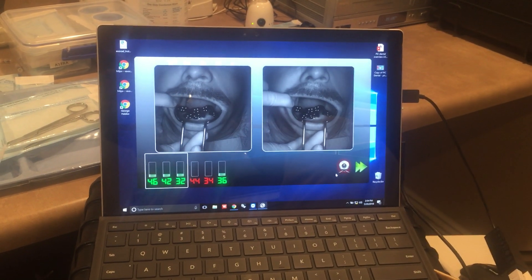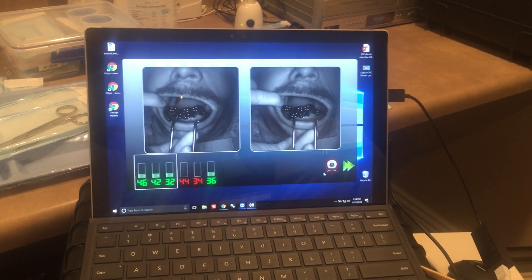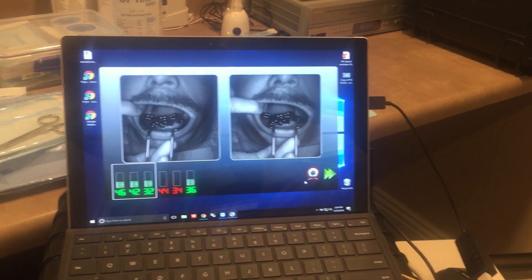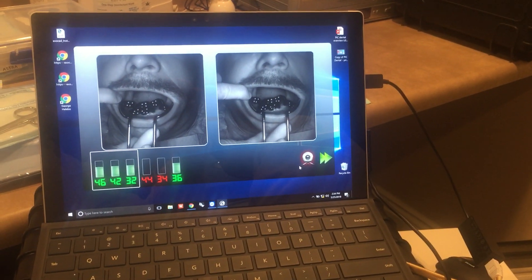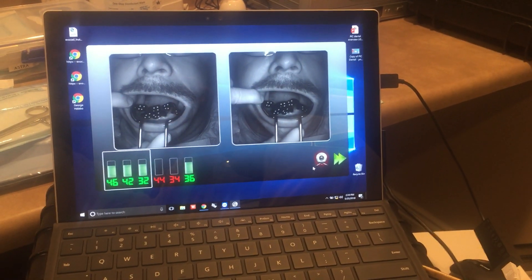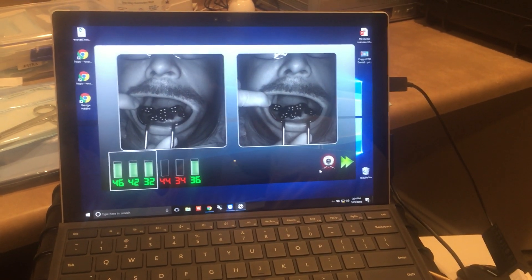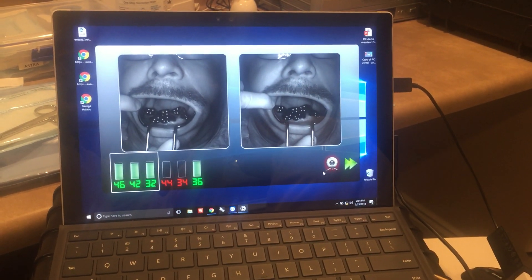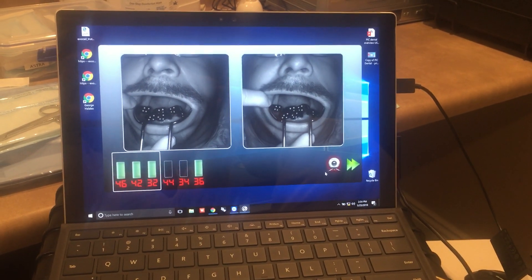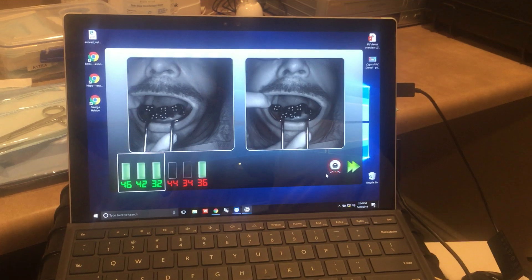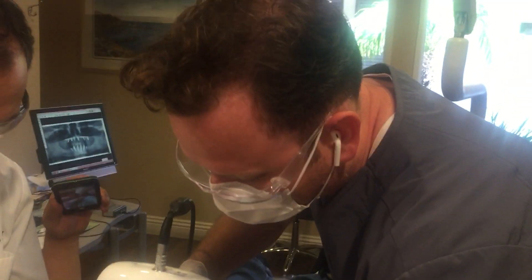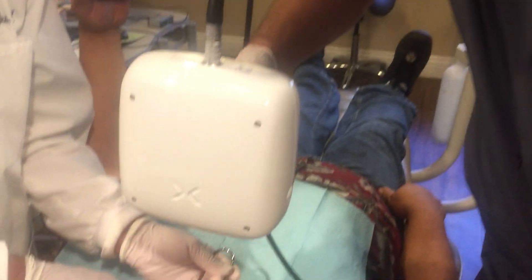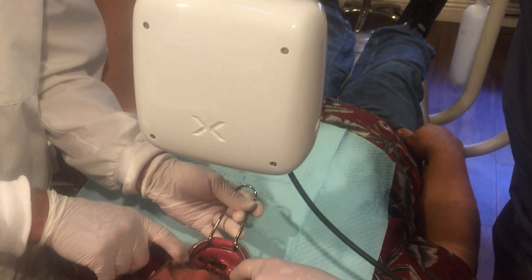Okay, so here we are with Al Crespo. We are taking an impression slash digital scan of Al's implants that he had placed with our California Implant Institute Free Dental Implant Program. Here's Camille from CAD Dental, and here is our scanner.